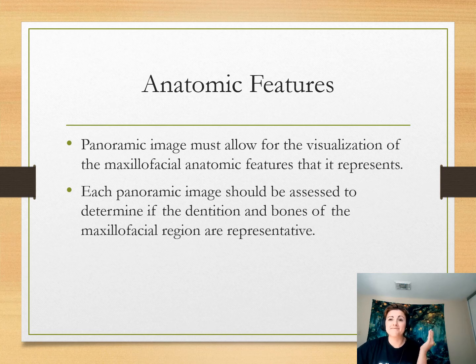That's what that means. We're going to look at box 22-1. You'll find it on page 251. It's going to break down all of the separate areas of what a panoramic should capture into little sections, and it's really, really nice. There are 6 areas of the panoramic, and each area should have these different parts.